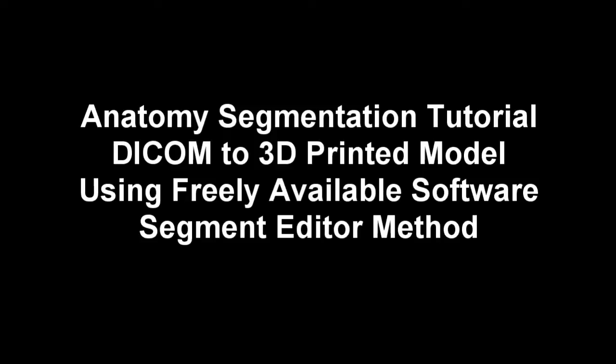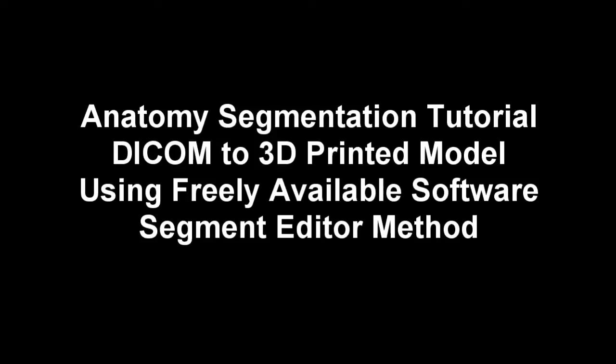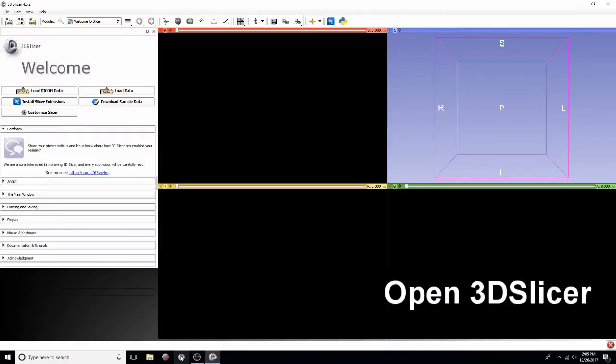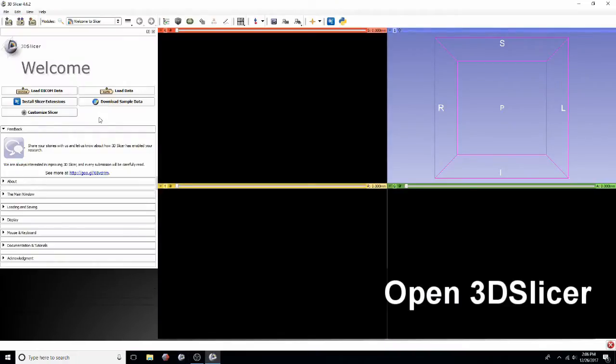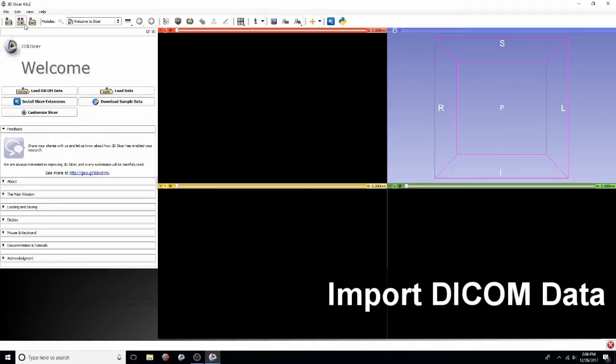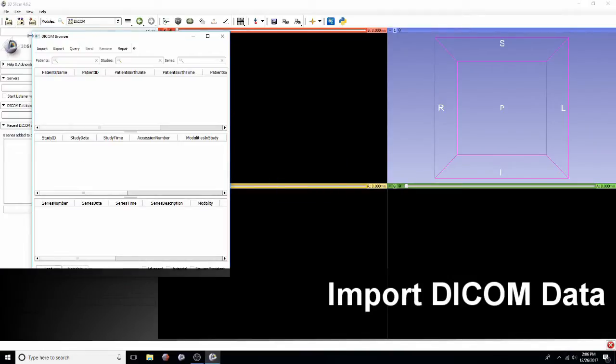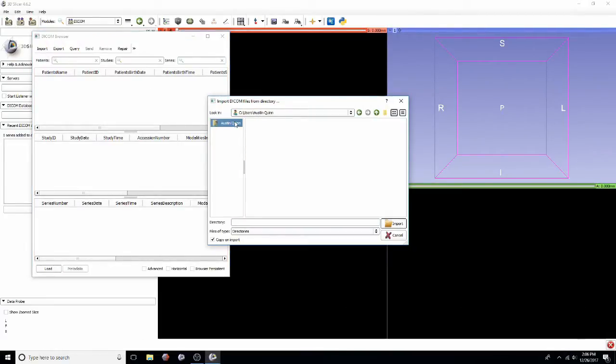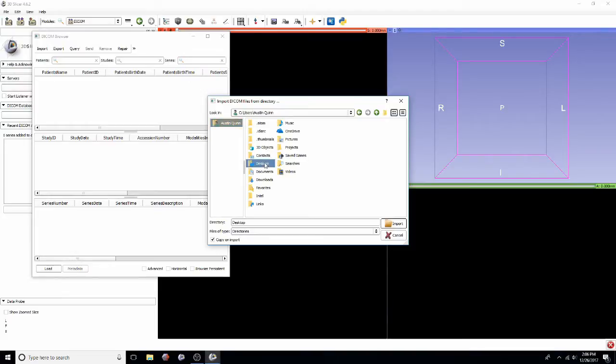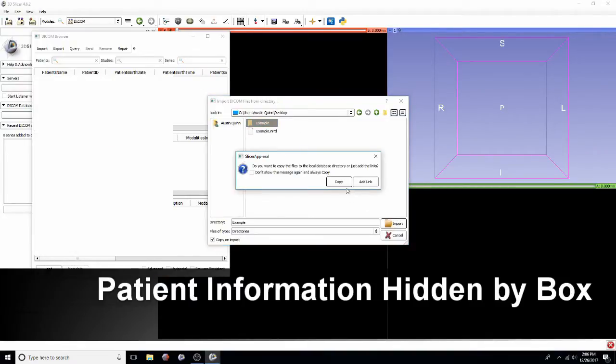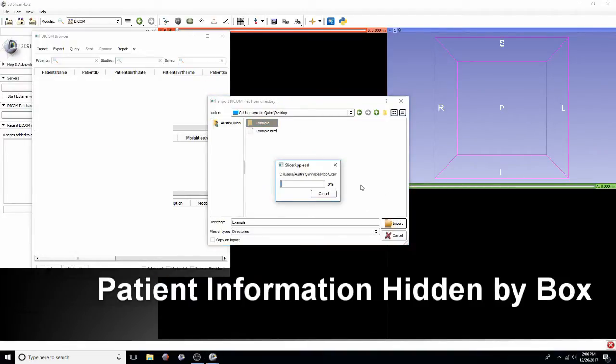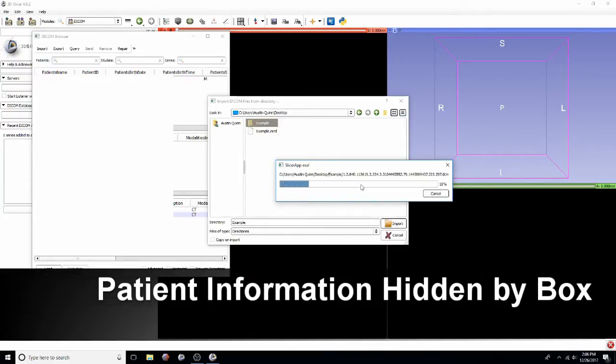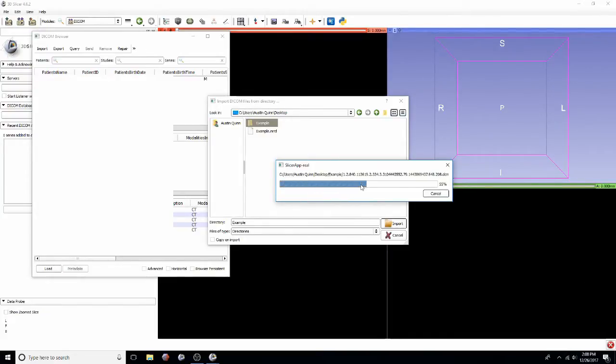So let's get started. First you'll start by opening 3DSlicer. You'll import any DICOM data that you want to view and segment. In this video I'm going to be covering all of the pertinent patient information with that white box that you can see over the DICOM browser just to protect their information.